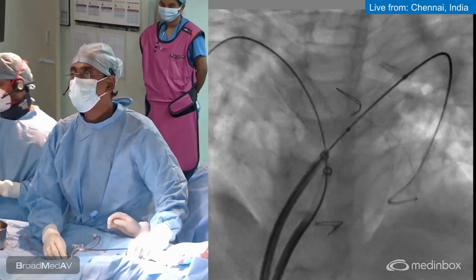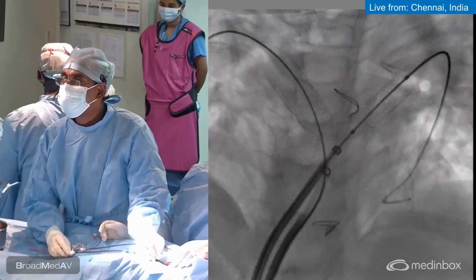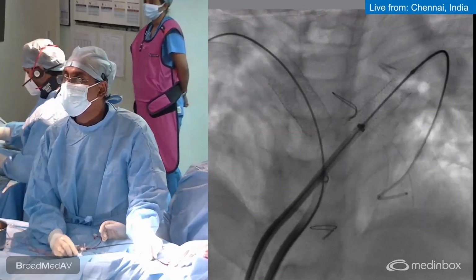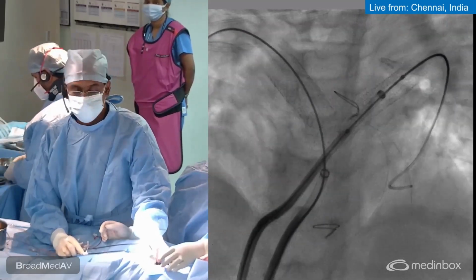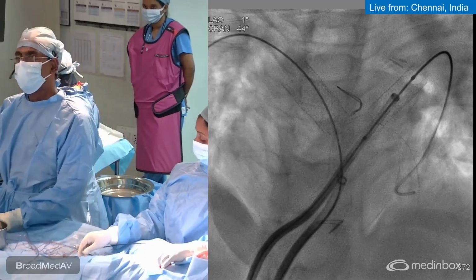let's get a 12 by 2 Mustang ready. It's fully deflated. So can you hold it?